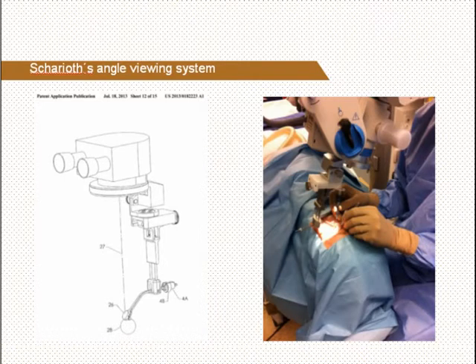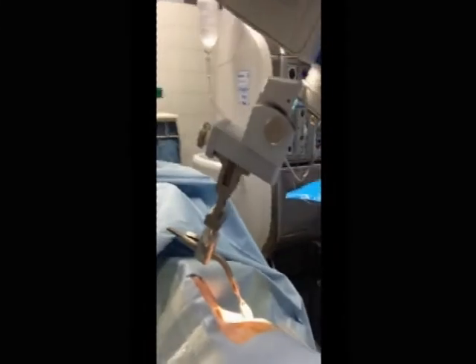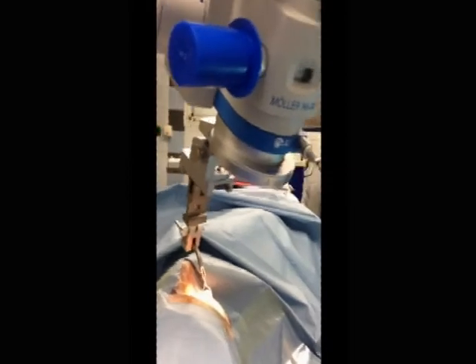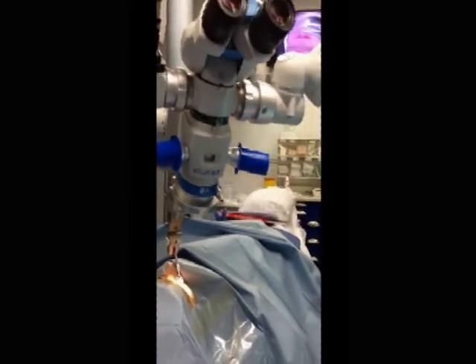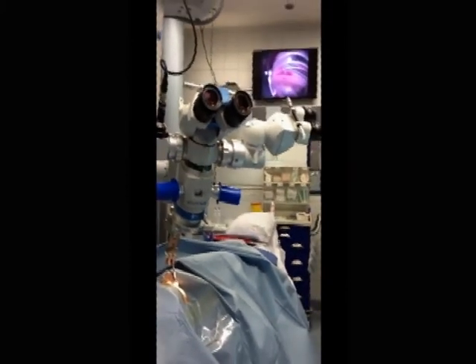In this video we would like to introduce a new microscope-mounted balanced angle viewing system. The aim of this development was to increase contact lens stabilization, improve intraoperative anterior chamber angle observation, and to allow bimanual manipulations in the anterior chamber angle. The microscope-mounted Scharioth angle viewing system allows hands-free stabilization of the gonio prism and gives an excellent and stable view of the anterior chamber angle.